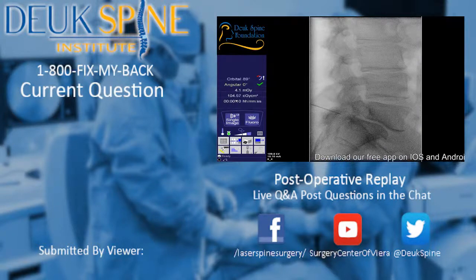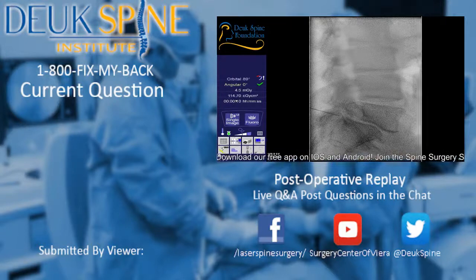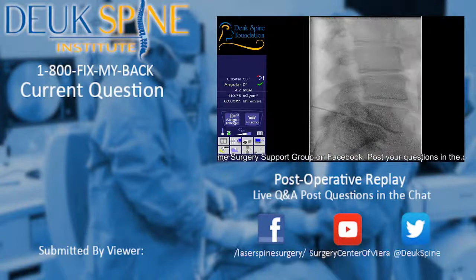What separates the Deuk Laser Disc Repair from all other endoscopic spine surgery on the lower back is that the Deuk Laser Disc Repair incorporates an annular debridement. Annular debridement means I'm using a laser to clean up the annular tear. No other spine surgery in the world cleans the annular tear up. The endoscopic surgeries that are currently done by other surgeons remove herniations but don't clean the annular tear. So they only treat leg symptoms, they don't treat back pain.